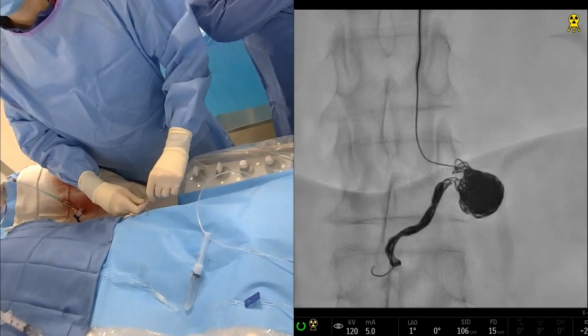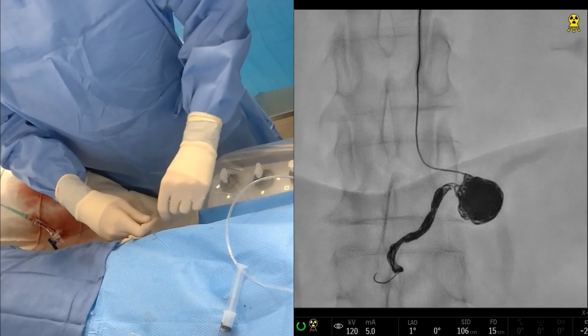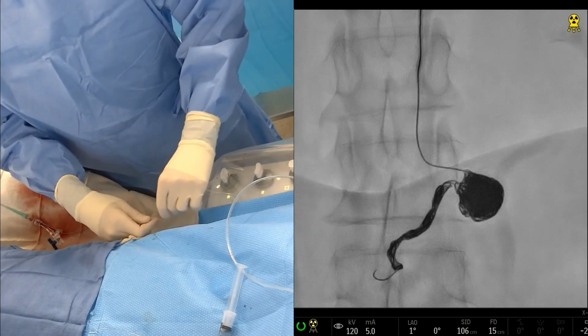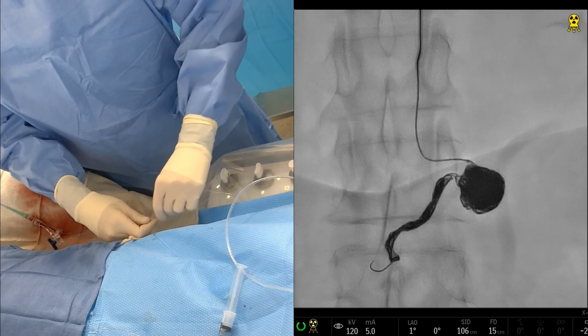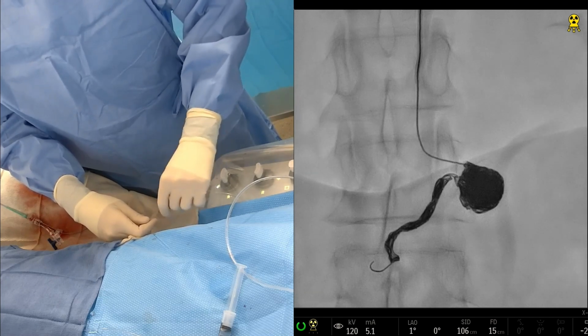And just to let the audience know, Tim, our chief resident, has been pretty much releasing the coils for all of them. And releasing, is that correct? Yeah, exactly. I'm not really doing a whole lot of work here.